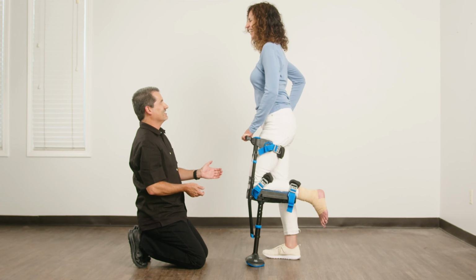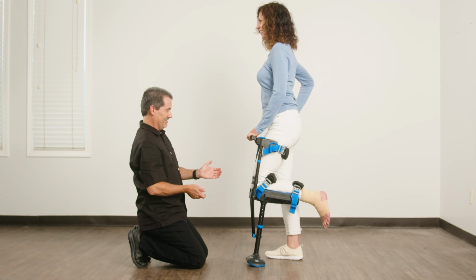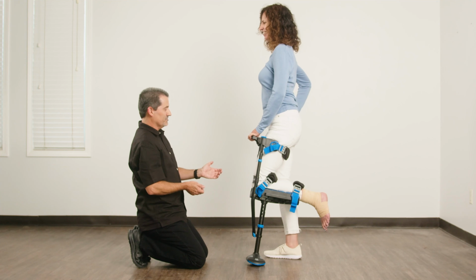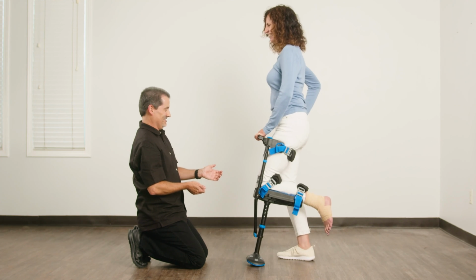Remember that your primary objective in these exercises is to get the patient to commit to getting their body mass forward of their foot before they initiate their step. This is what happens in normal walking. So when they do this, walking with the iWALK will feel familiar because it's much like normal walking.